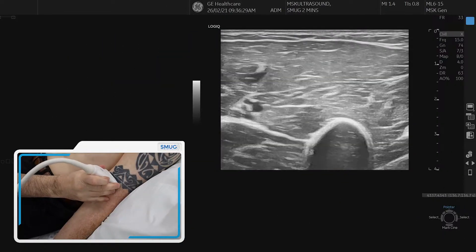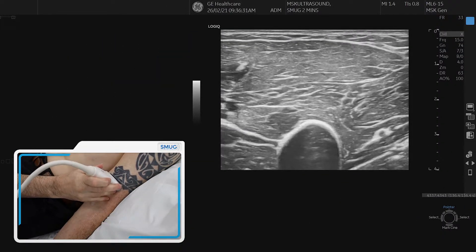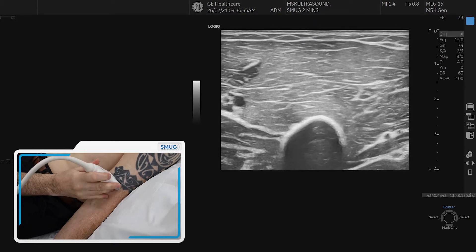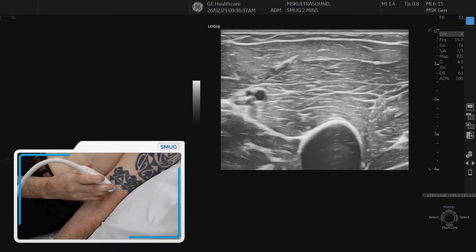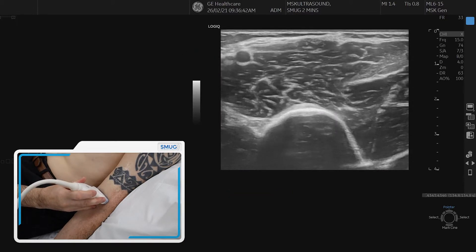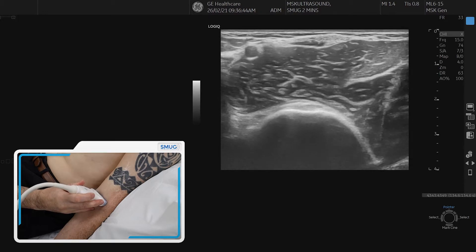We're going to show you a few ways of assessing the distal bicep tendon. We start with the anterior approach and then we do the medial approach. With the anterior approach, you can start with the musculotendinous junction. If you go distally, you can see the tendon forming under the superficial fascia — the short head and the long head.